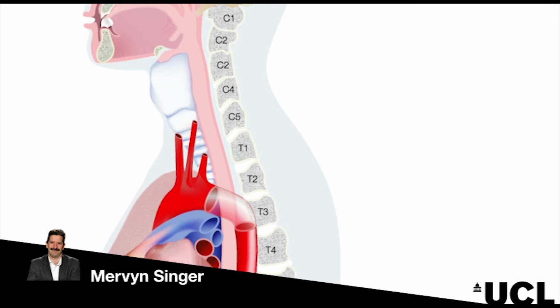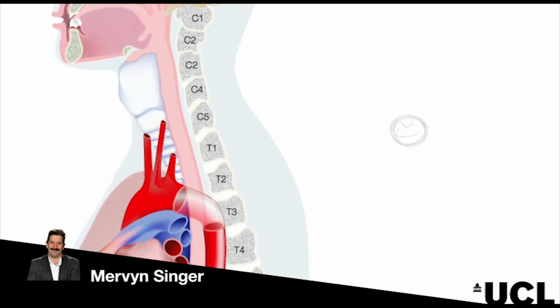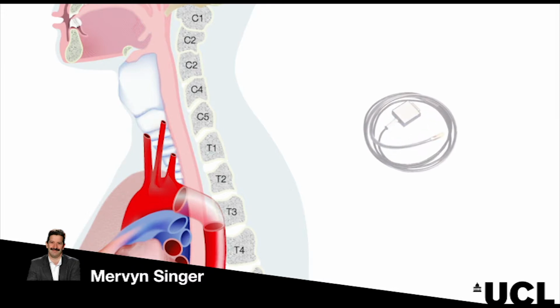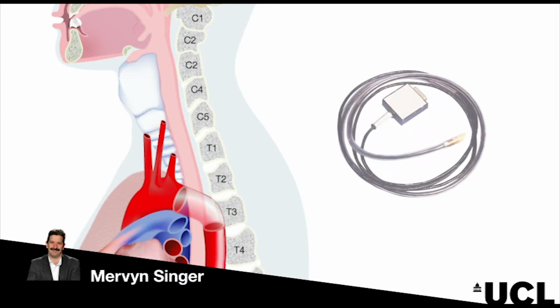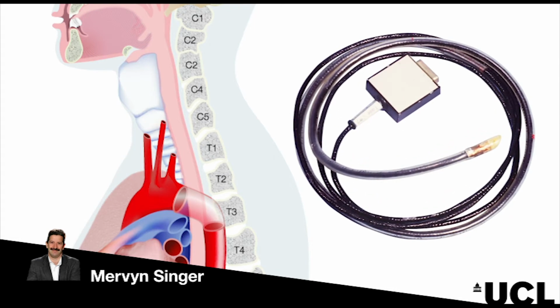The company, Doptek, then very kindly made a prototype esophageal probe, which was actually built in, araldited, glued into a large bore nasogastric tube. And there was an angle on the face of the probe of 45 degrees, because in the Doppler equation, there's a cosine of the angle between the direction of the sound waves and the direction of the moving blood. So a known angle was introduced of 45 degrees.